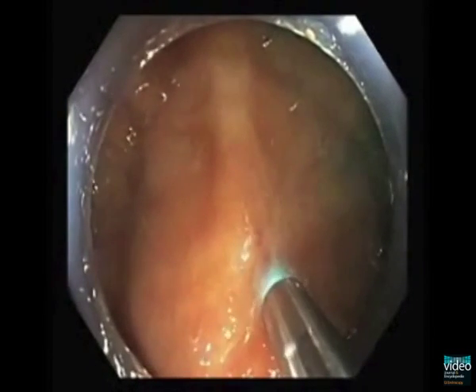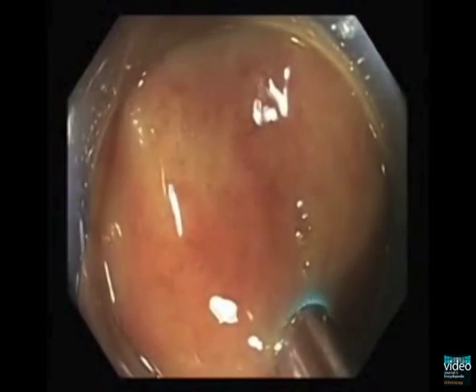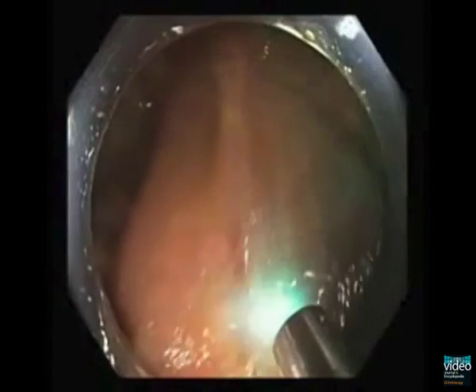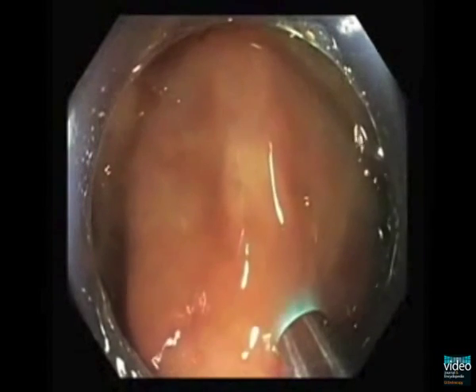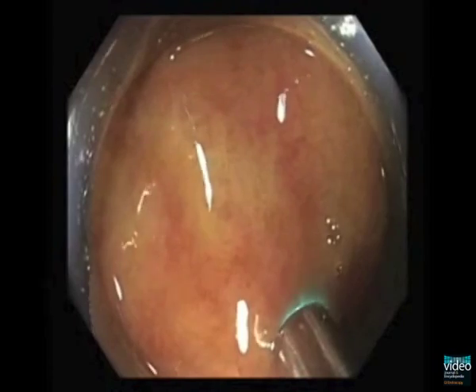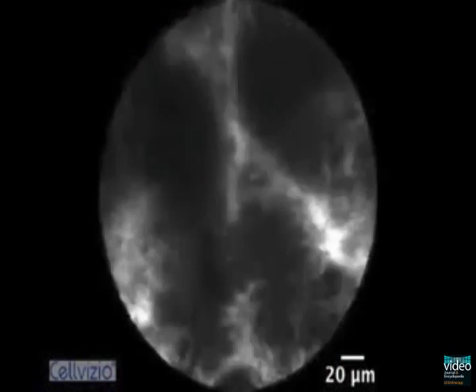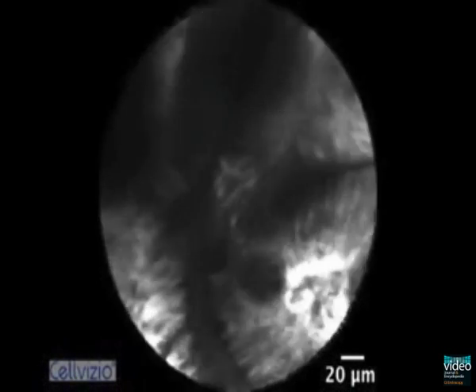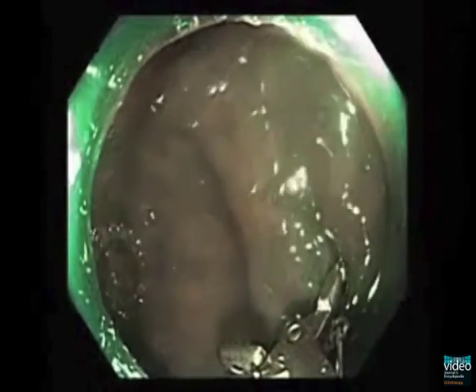Using confocal endomicroscopy in this setting is very helpful to determine if further resection or ablation is needed. Applying the confocal probe-based endomicroscope, we can obtain good imaging of the tissue. Here you can again see the cap used to stabilize the image. Once in good position, we can visualize the endomicroscopy view. Again, we're looking for areas of darkened epithelium, which are clearly evident in this case.